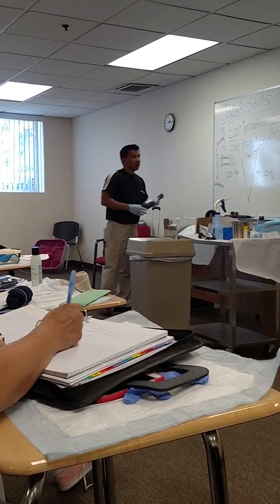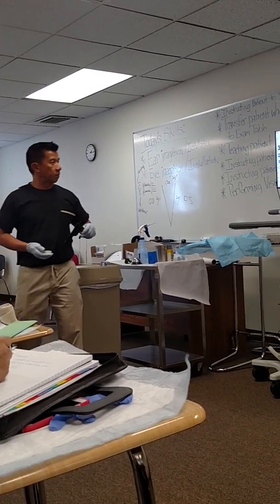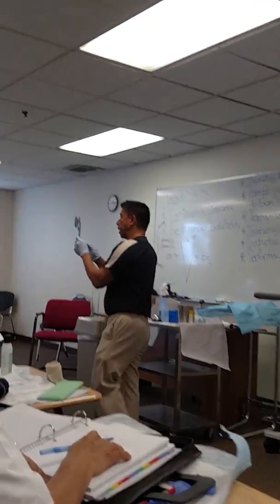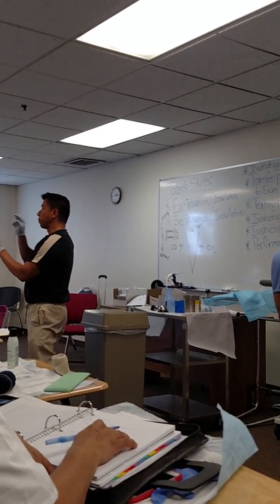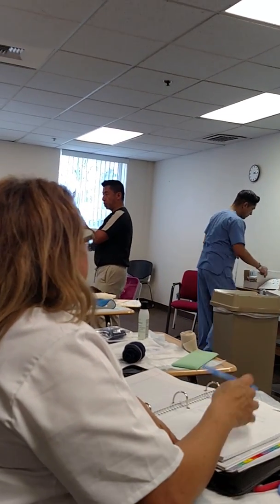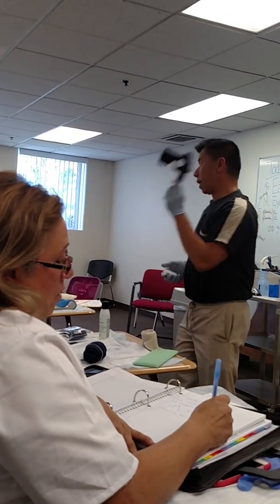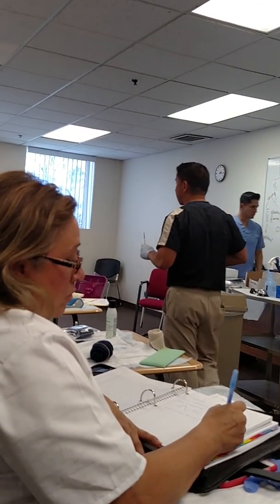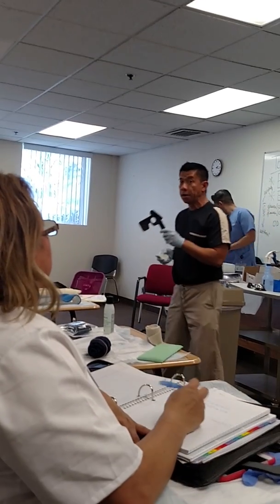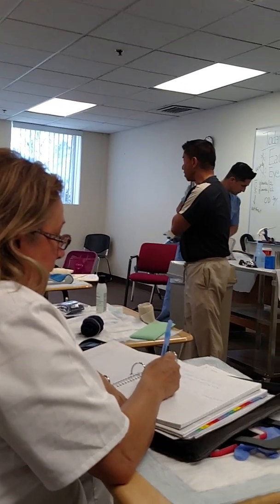Okay. Now, we are going to start working on the visual acuity. Eric is my patient, at 20 feet distance away from the chart. Now, this is what we call an occluder. An occluder has pinholes, and the pinholes are supposed to sharpen your vision. So you're going to check the patient's eye without the pinhole first. It's always good practice to start with the right eye. If you're checking especially the elderly who want to pass the driver's license, they're sneaky, and they read the chart with both eyes instead of one eye.